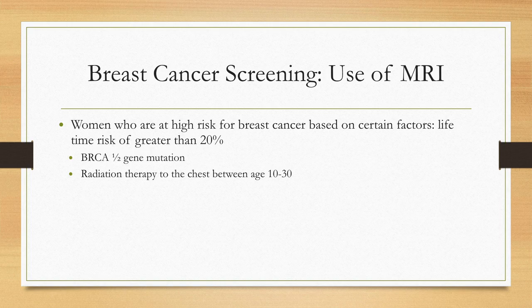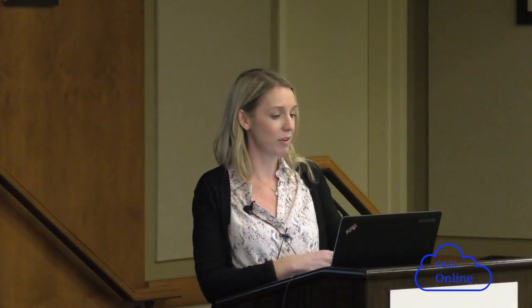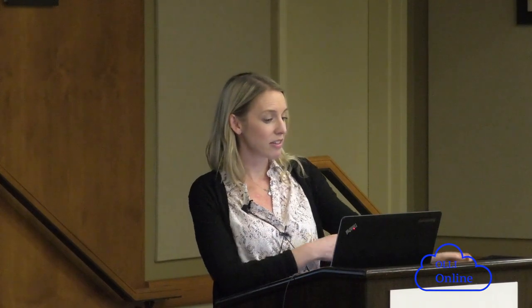But there's more and more literature showing the people that fall into this intermediate risk category, which would be the 10 to 20%, would benefit highly from screening breast MRI. Some places around the country are now doing abbreviated protocol MRIs, where it's like a 10-minute MRI, limited, quick look at the breast. We don't have that here. It's still kind of mostly at academic institutions, but it is something that we'll probably start seeing universally more.